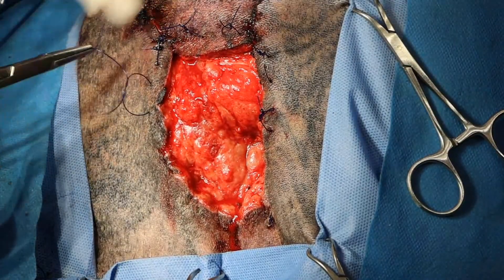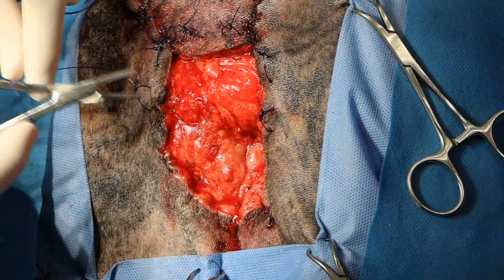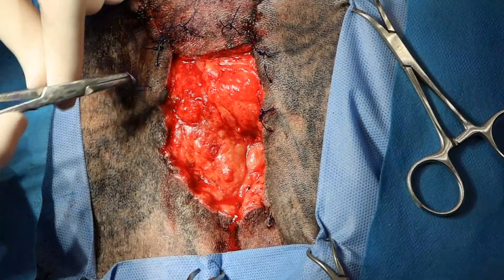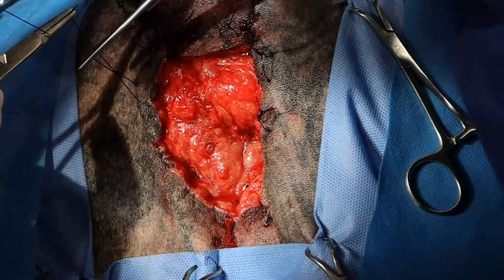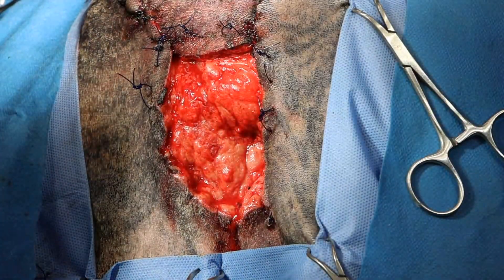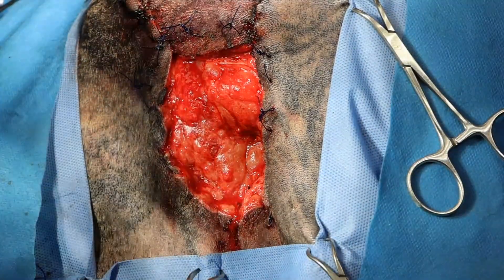For some reason, this needle on this OPDS is smaller, which I love. I love a small needle. That's 2-0 over there — that's 0. Yeah, so I think it's a smaller needle. I like a small needle.